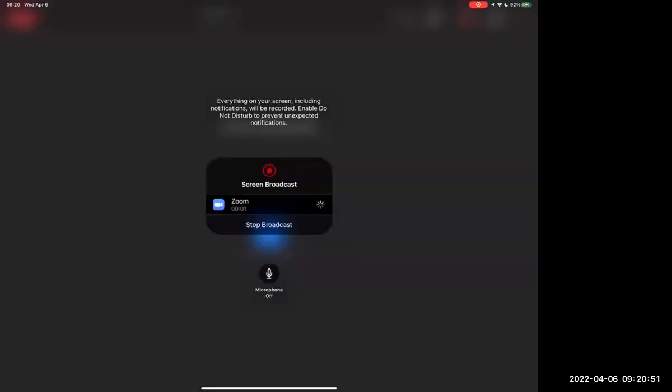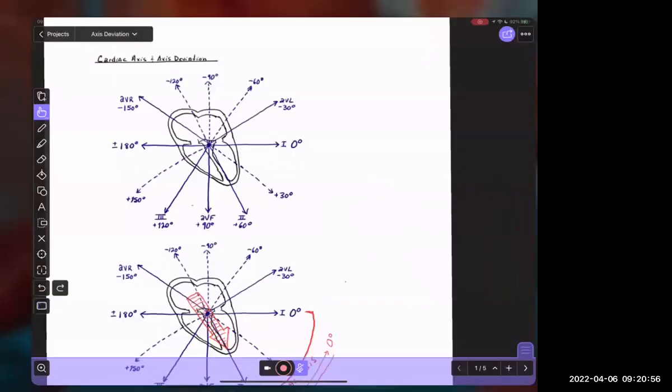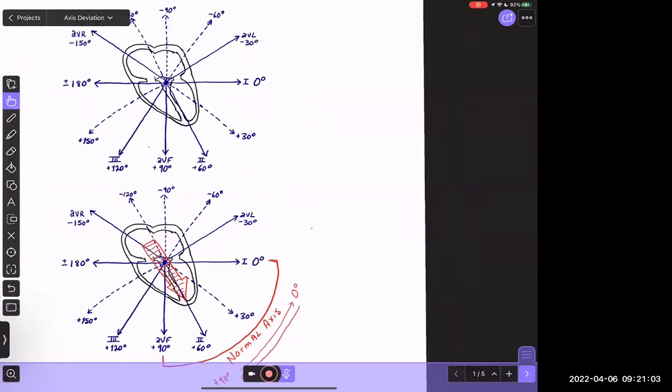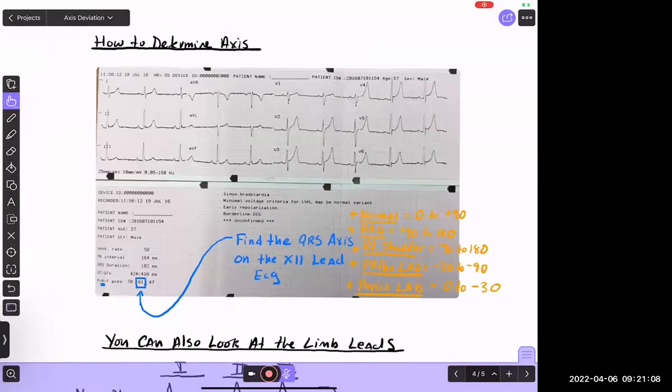So if you were to look on your 12-lead EKG and look for QRS axis, the degrees that you should see should be between 0 and 90. And that makes sense because, again, the general direction of the forces, the general direction of depolarization in the heart, is moving from the right to the left and downward. Okay. So let's talk about, oops, we're at right axis already.